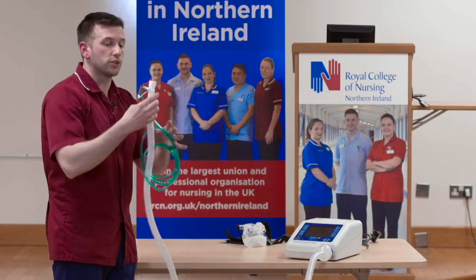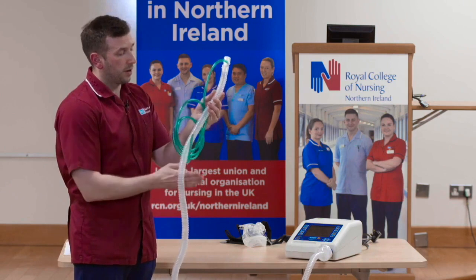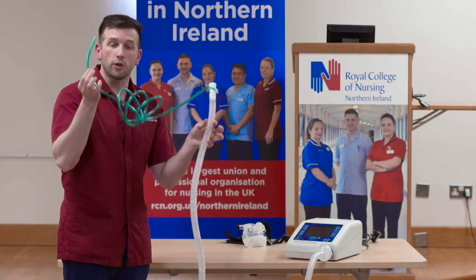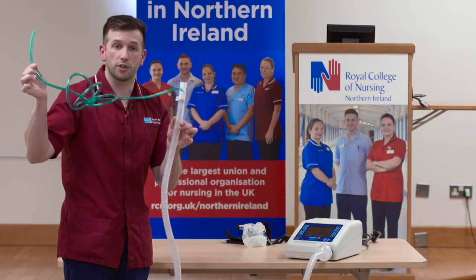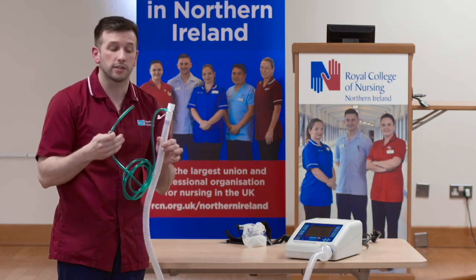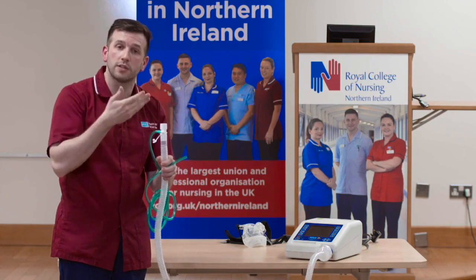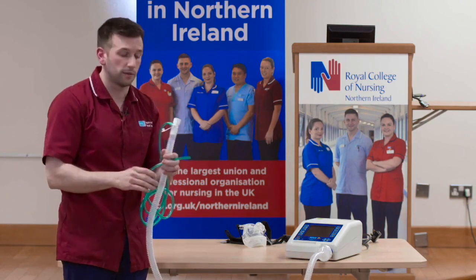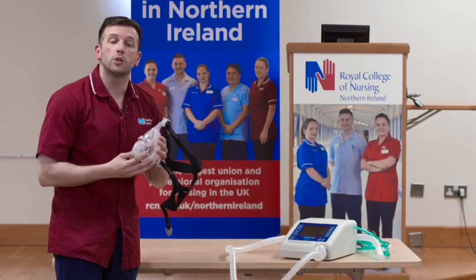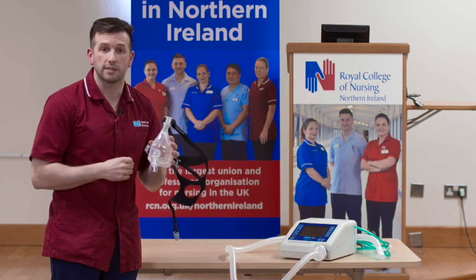As you come towards the top of the hose, you're going to see an oxygen entrainment port. The purpose of this fine bore oxygen tubing is to connect to oxygen therapy so you can deliver supplemental oxygen therapy if required. Our local policy is that we would like to entrain oxygen therapy as close to the patient's mask as possible. Next, we need to locate the interface that's required for your patients to receive this therapy.